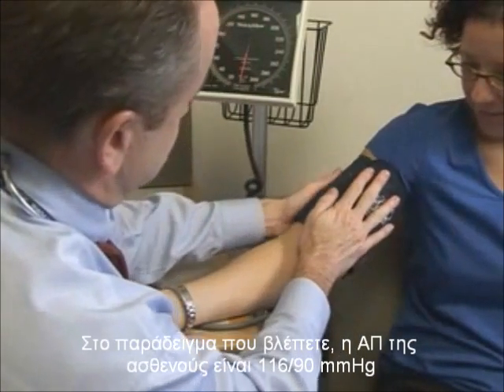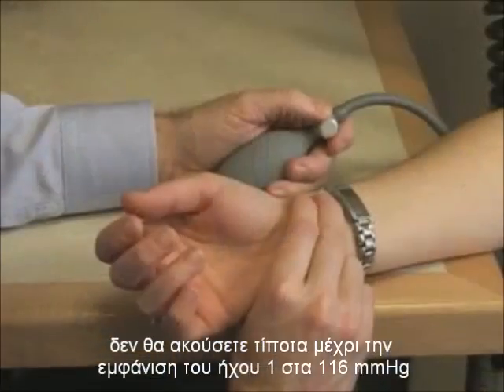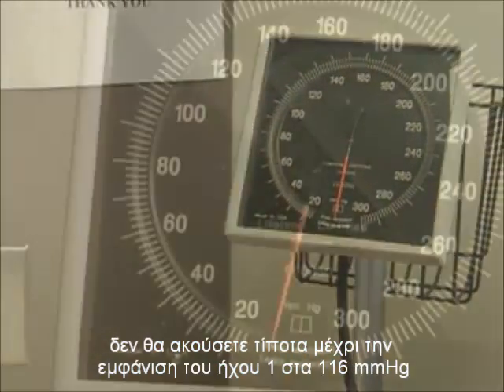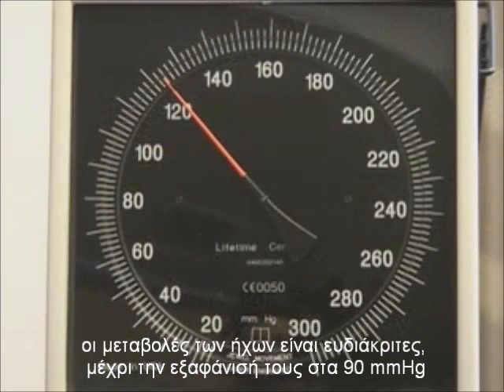In the following example, the patient's blood pressure is 116 over 90 millimeters of mercury. You will hear nothing until the first Korotkoff sound appears at 116 millimeters of mercury. The various phases of Korotkoff sounds will be heard until their disappearance at 90 millimeters of mercury.